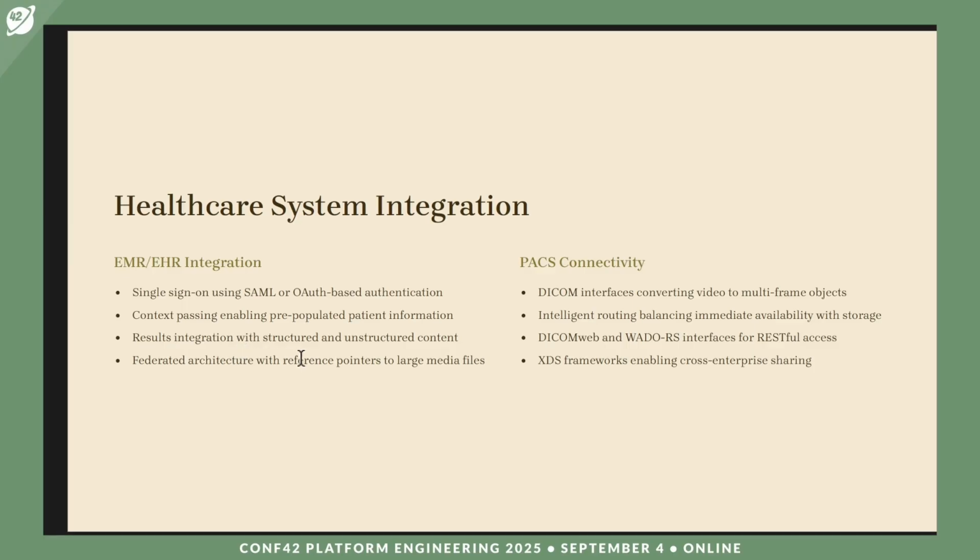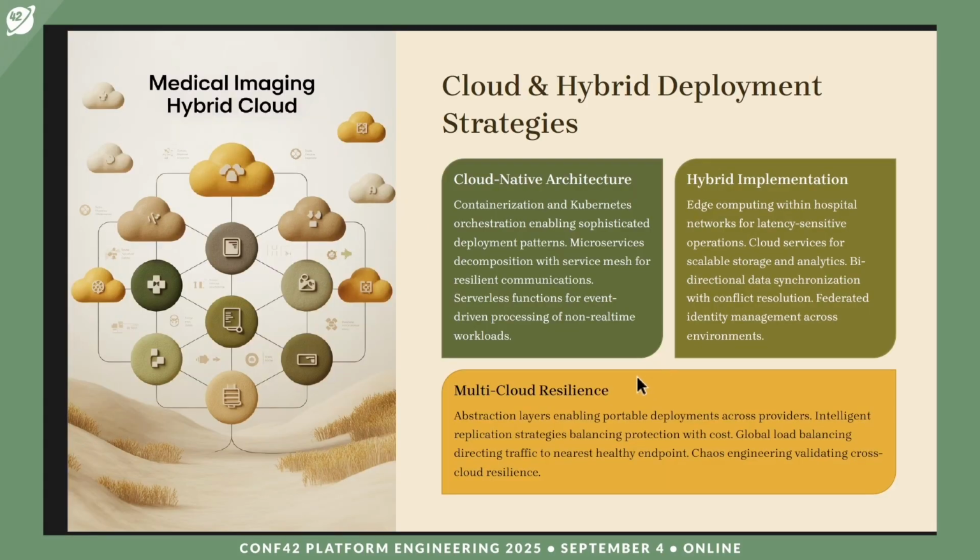Healthcare system integration: single sign on, a federated architecture with reference pointers, PACS connectivity, DICOM interfaces converting video to multi-frame objects, intelligent routing balancing immediate availability with source storage, DICOMweb interface for RESTful access, and XDS frameworks enabling cross-enterprise sharing.